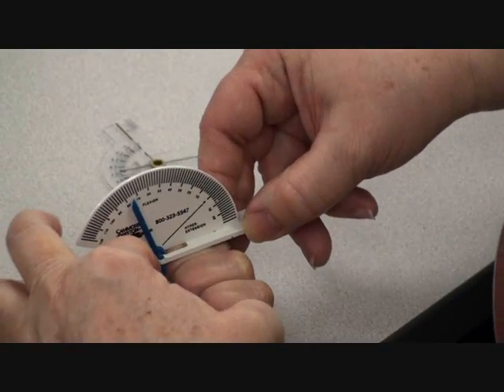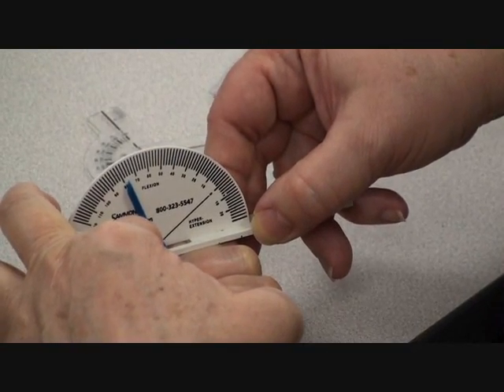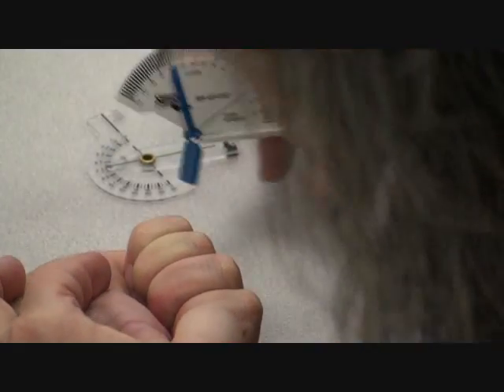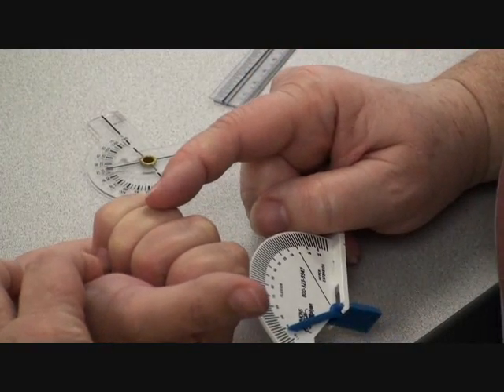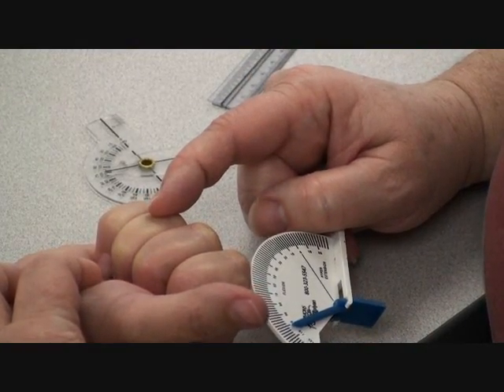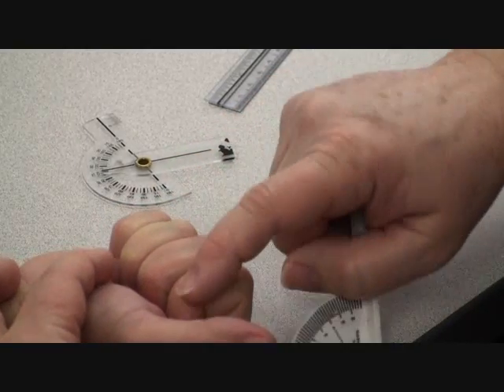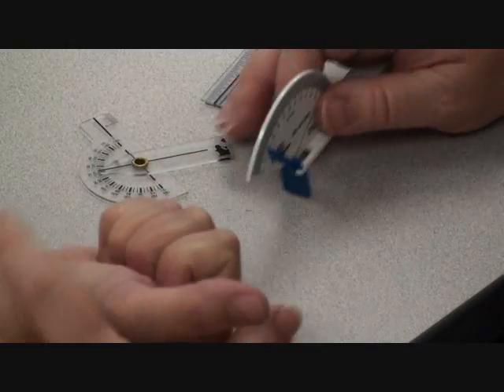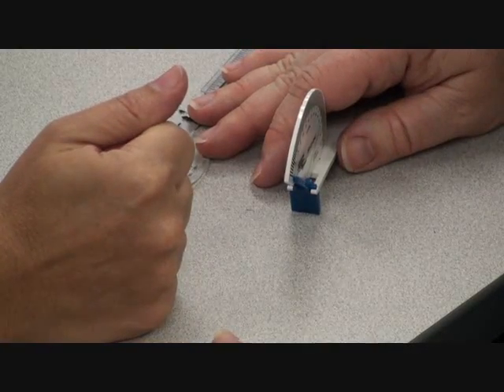And so in this one, I got about 76, which, looking, I mean, it almost looks deceptively close to 90. So 76, we're not going to be scared by that number even though this one was only 60. So I think we have it.